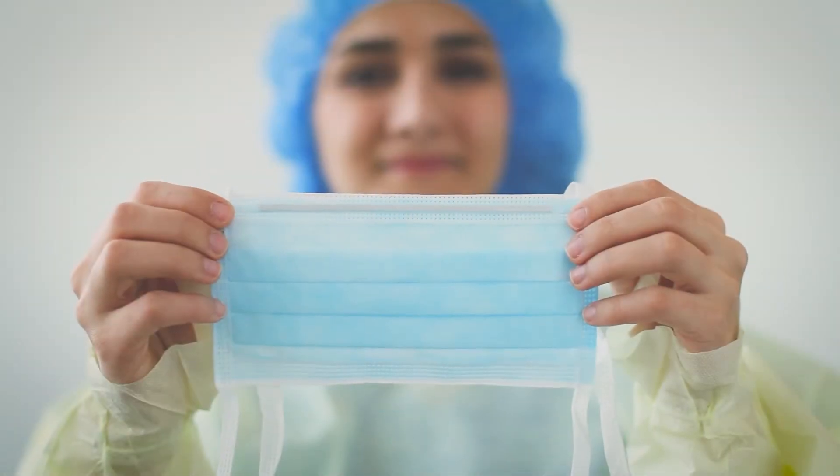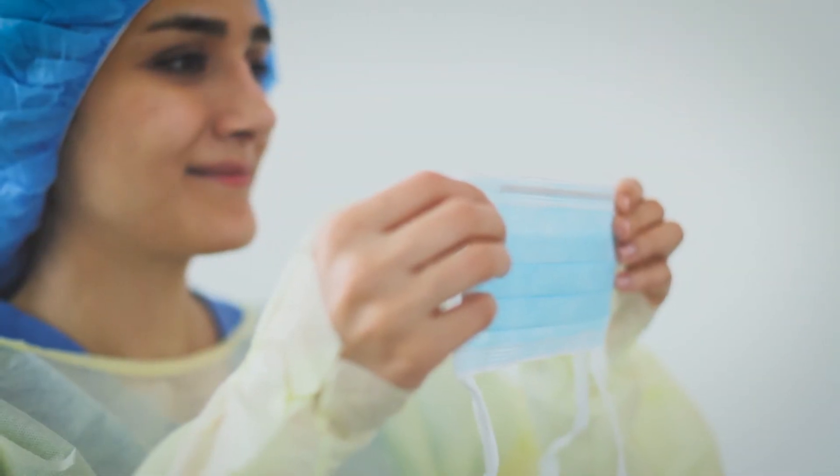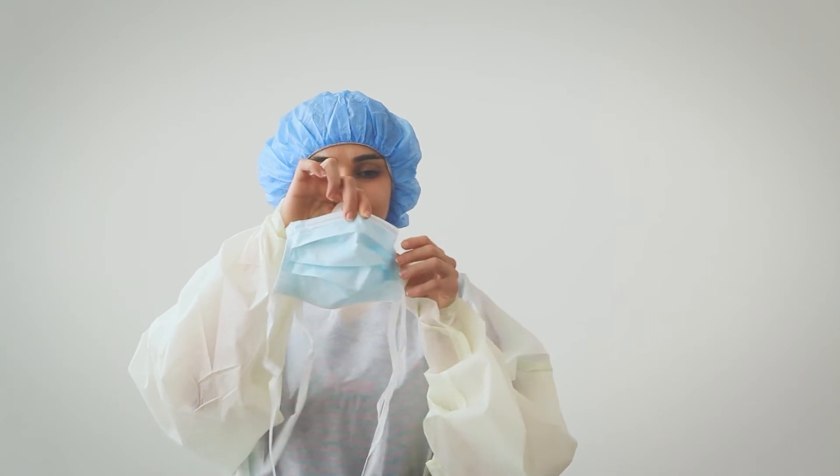Hold the mask with the outer layer out and pleats folding down. The outer layer is usually colored and should be away from your face when donned. Pull to open the pleats.